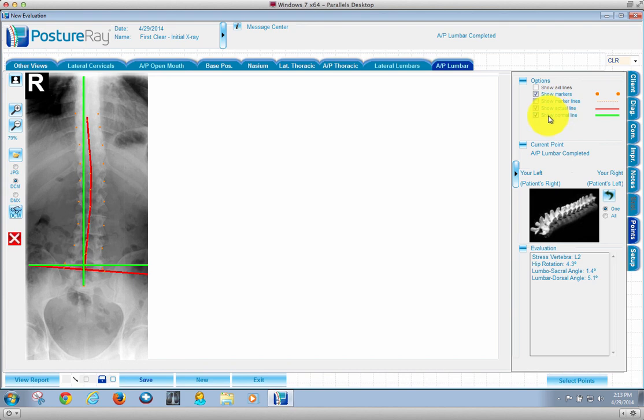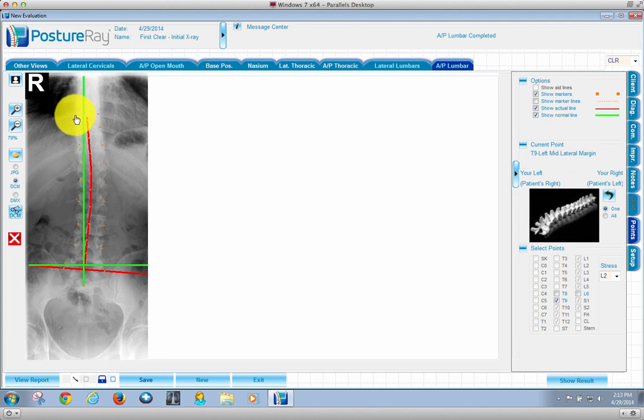So with that said, that is how to do the analysis of an AP lumbar non-scoliosis view in clear technique for PostureRay.